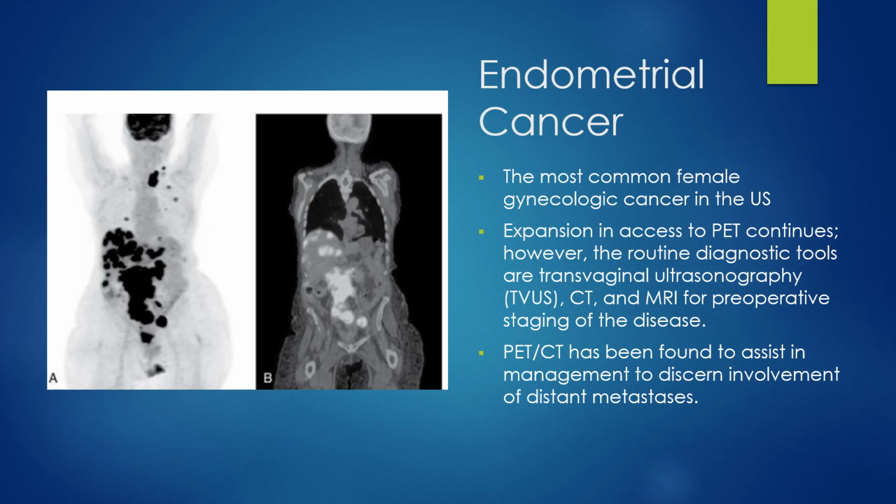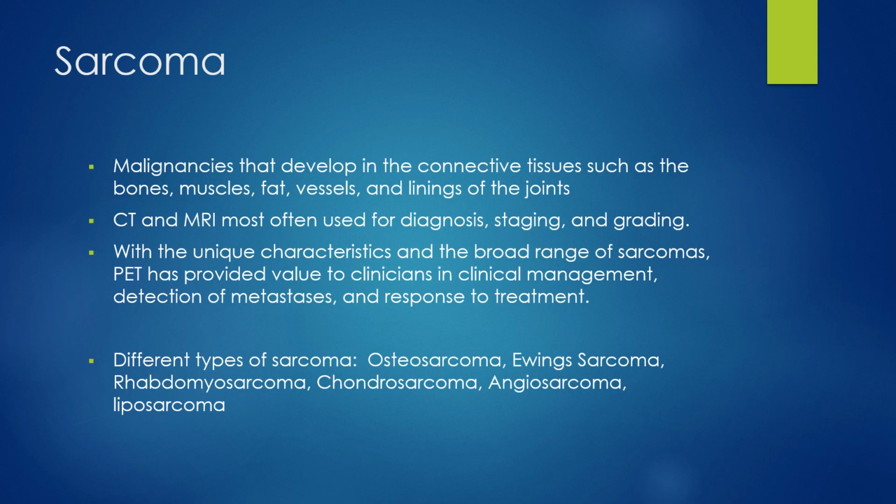Endometrial cancer is the most common female gynecologic cancer in the U.S. Expansion in access to PET continues to improve the routine diagnostic tools. Typically, patients get transvaginal ultrasound, CT, and MRI for preoperative staging, but PET-CT has been found to assist in management to discern involvement of metastases and also in treatment response.